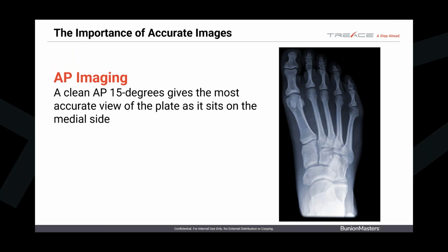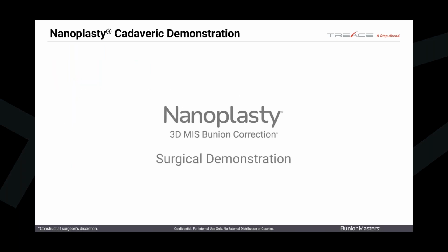It hasn't changed. Patients weight bear pretty early on this, so it's not going to be a plantar flexed metatarsal that occurs with weight bearing. It's going to be dorsal. And it looks plantar when you have an inverted foot X-ray. So be careful. So let's go through the actual cadaveric demonstration.